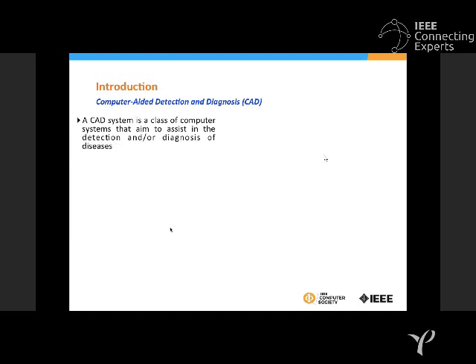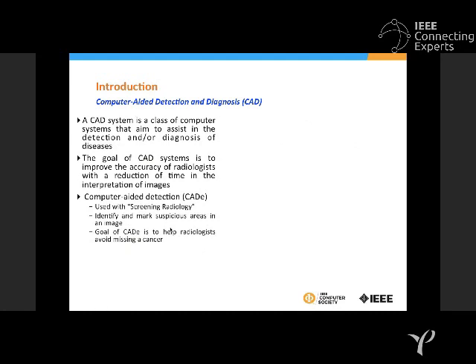So first we detect a particular region in a given image sample, that okay, there is something in the region. We put some mark in the particular region. It may be a tuberculosis patch, or it may be a nodule in your lung or brain, and then we try to explore it in a much better way, and try to find out the risk associated with the particular patch. So if I try to summarize the thing what I try to tell you.